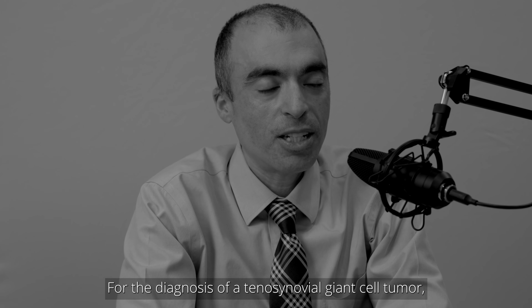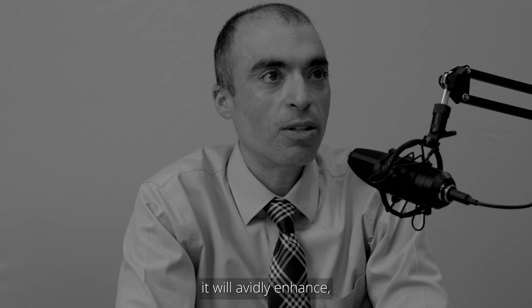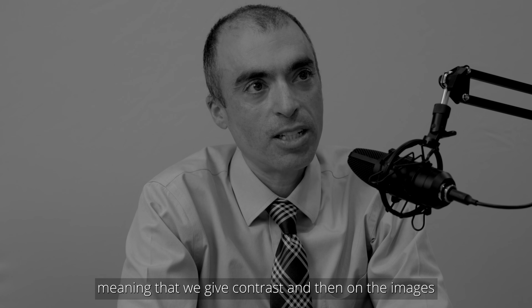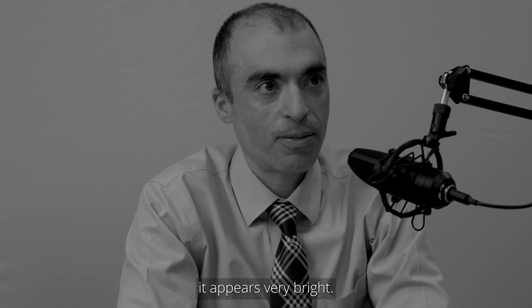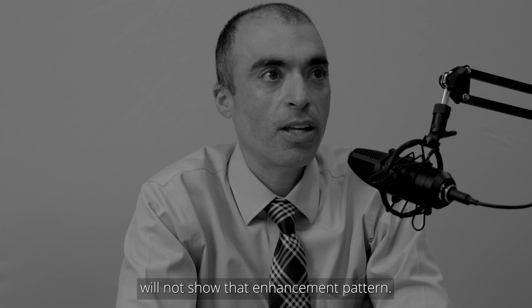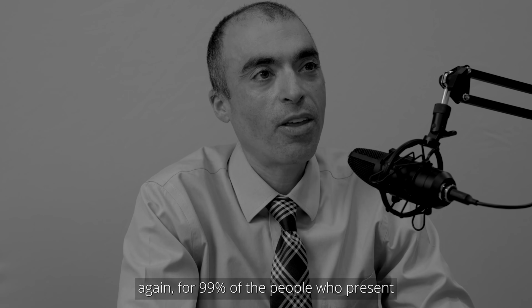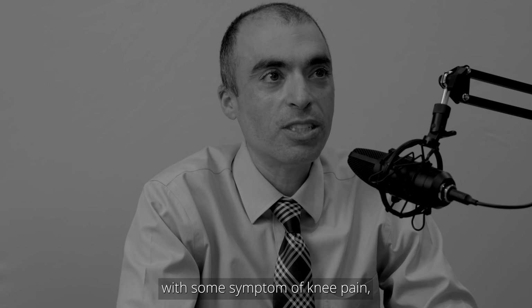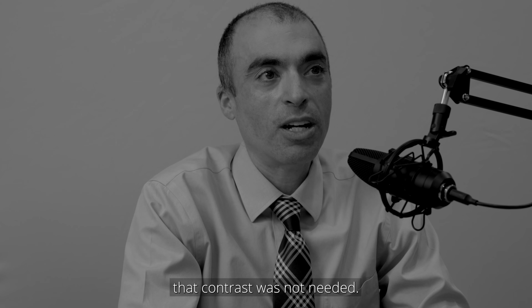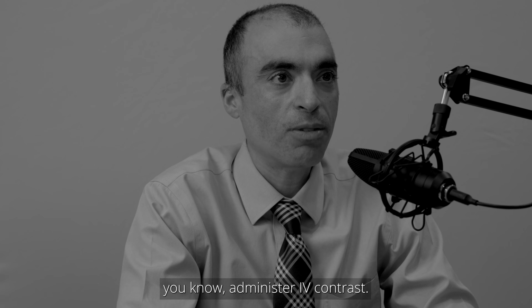For the diagnosis of a tenosynovial giant cell tumor, the administration of IV contrast is really helpful in that classically it will avidly enhance, meaning that we give contrast and then on the images it appears very bright. Conversely, an intra-articular body from just arthritis will not show that enhancement pattern. So the administration of contrast can really distinguish between the two. However, for 99% of the people who present with some symptom of knee pain, that contrast was not needed. So that's why we usually do not, for most patients, administer IV contrast.